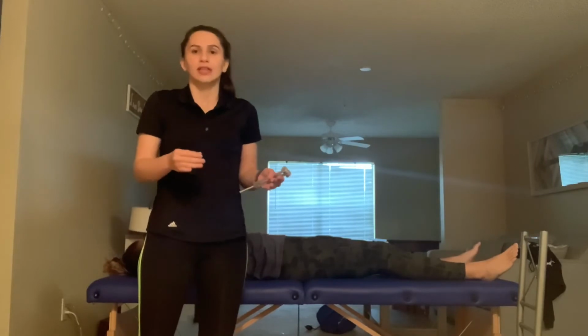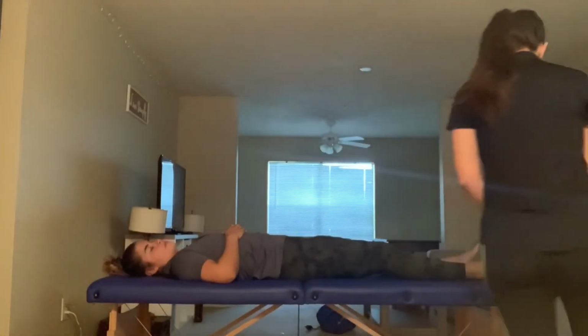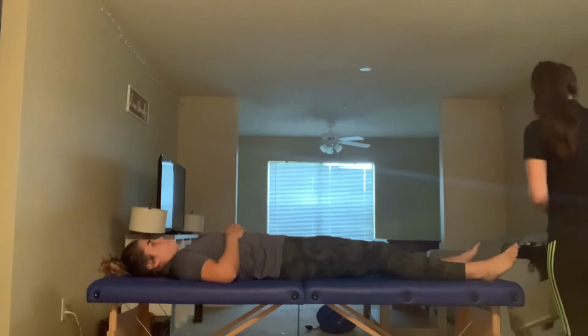Next, we are going to demonstrate how to assess for a fracture using a tuning fork in some of our smaller bones like the navicular, which we will be showing in this video. Unlike long bones radiating the percussion sound into the stethoscope, smaller bones will elicit a greater feeling of pain when touched with a tuning fork if a fracture is present. A rule of thumb when using tuning forks to rule out fracture is that if the area is too deep to be palpated, most likely it is too deep to be assessed with a tuning fork.